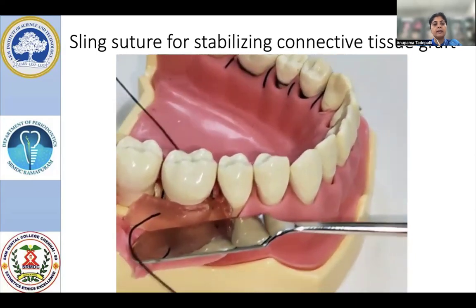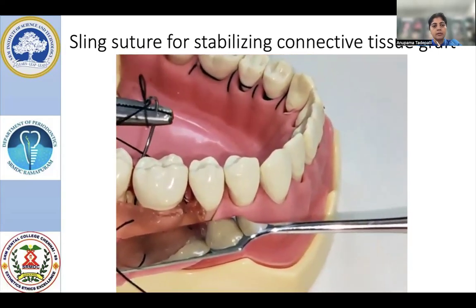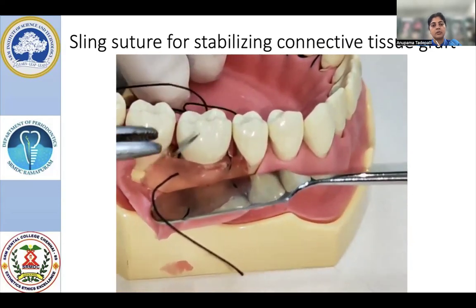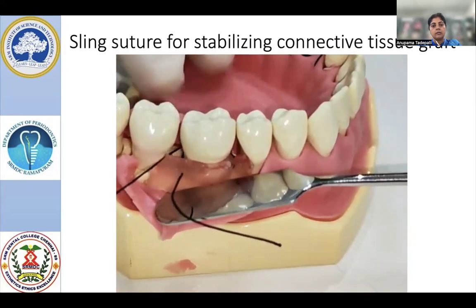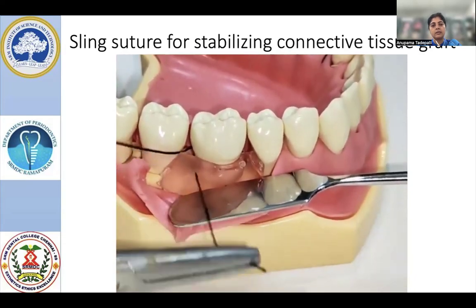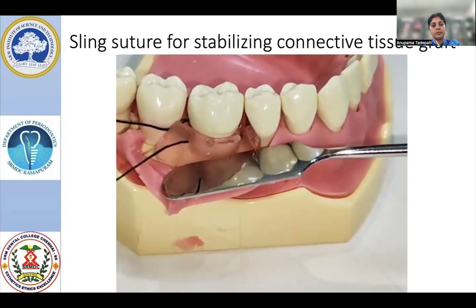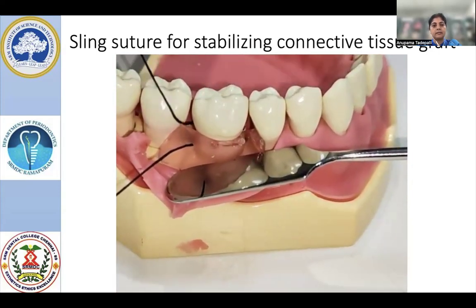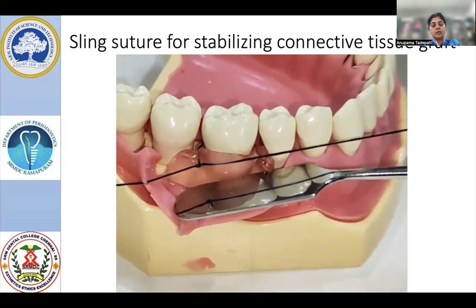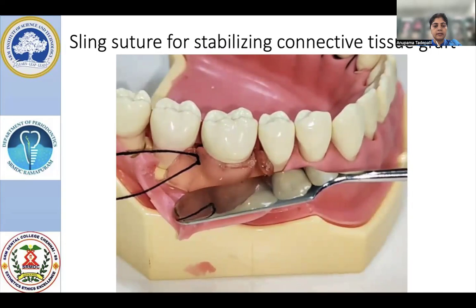You will encircle lingually again and come onto the first interdental area where you will place the knot. Before placing the knot, check that there is enough tightness in the suture and the graft is well stabilized onto the prepared root surface. We have emerged into the first interdental area where we started and are checking for any looseness, verifying the graft is properly adapted. Whenever we use this kind of suturing technique, preferably use resorbable suture material, since the CTG or collagen biomaterials are mostly resorbable materials.